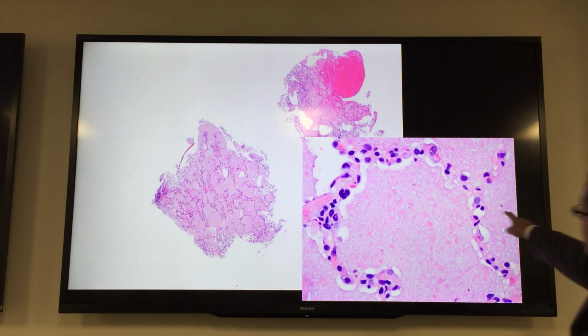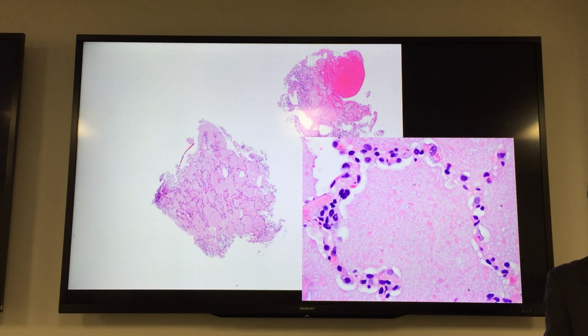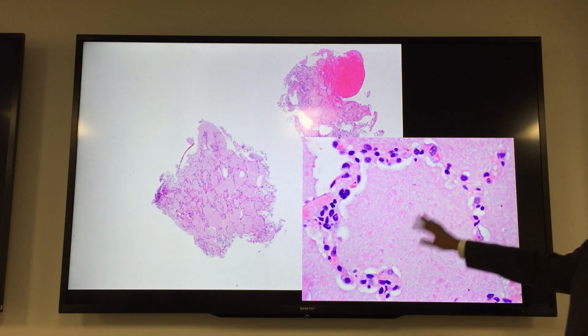So there is alveolar septa, airspace, and you see that at low magnification. Anyone? Is it normal? There is a hyaline-like material. Yes. Amorphous material. What do you think it is? Alveolar proteinaceous. Yes. So not hyaline-like, but it is proteinaceous. And it fills up the air spaces, right?